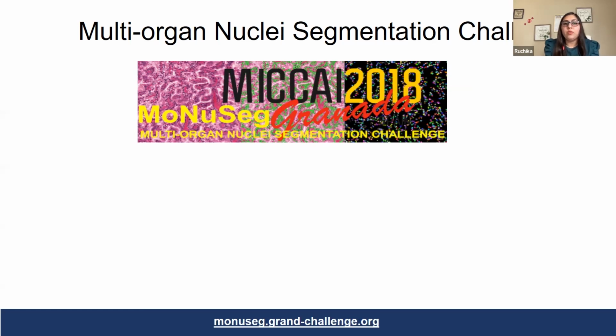But I think now we are more interested in nuclear segmentation and classification, because we are getting enough performance with the nuclear segmentation. In nuclear segmentation and classification, we can assess the tumor microenvironment, because we know what types of cells there are, like, let's say, what is the concentration of immune cells. We can use that to build further or identify prognosis or treatment response in the later stage.